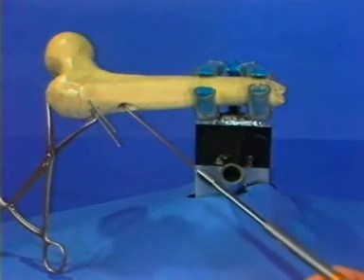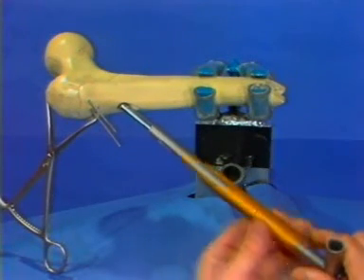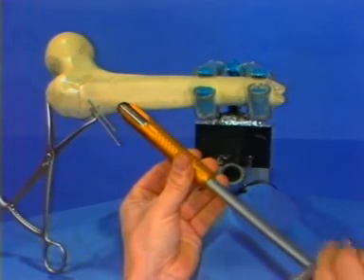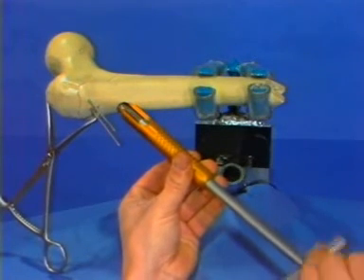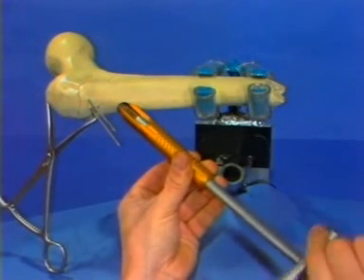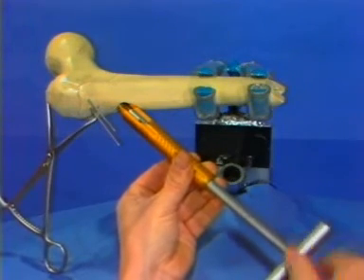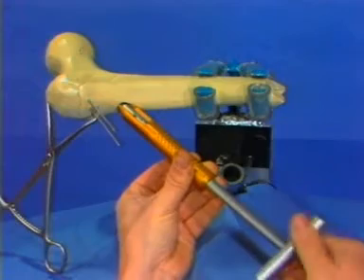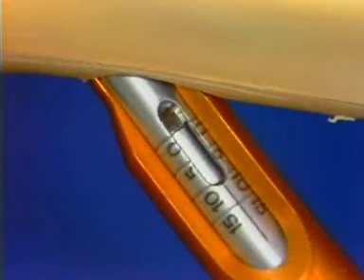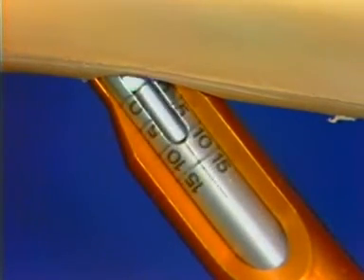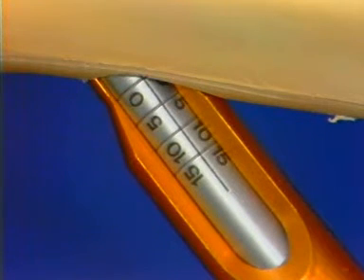This is then placed over the guide wire and screwed into place. As soon as the zero mark of the screw wrench assembly reaches the lateral cortex, the DHS screw is at the end of the drill hole, as shown here. This means that the point of the DHS screw is 10 millimeters from the joint.